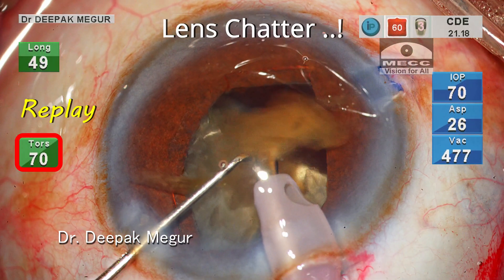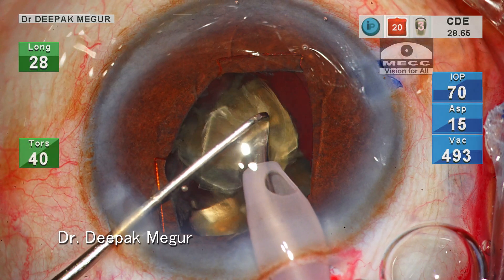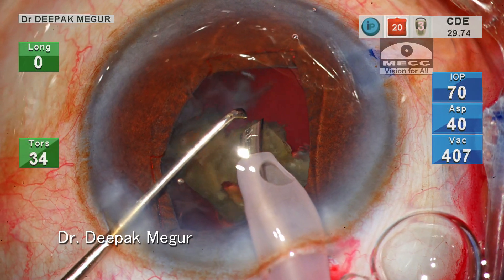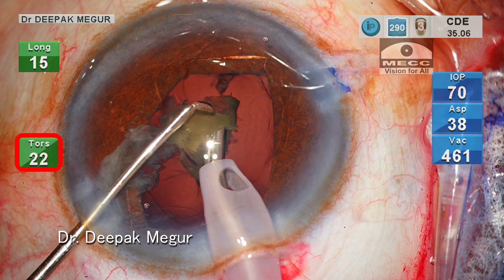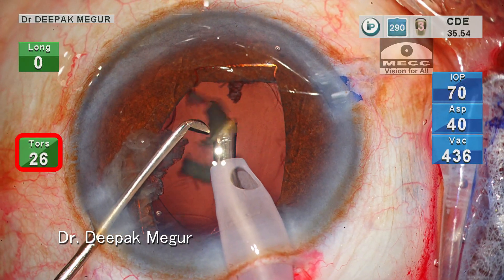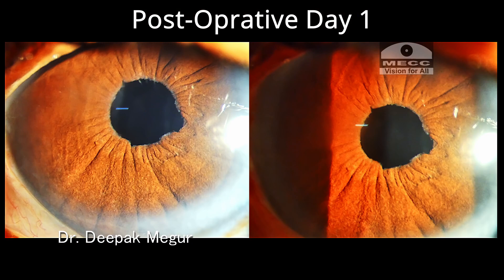Let me rewind and show these two clips in slow motion. Here the emulsification is happening in an uncontrolled manner, causing the fragment to burst open and tiny debris flying around everywhere. On the contrary, this scenario shows the entire process very well controlled — the energy used is much less. Of course it has slowed down the procedure, but the nuclear fragment is just dancing around the tip gracefully before diminishing in size and then vanishing. It's quite pleasant to watch, and I can bet the cornea also likes this technique a lot. We will always find a happy and smiling cornea the next day if we perform emulsification in the right plane by using the right amount of energy.